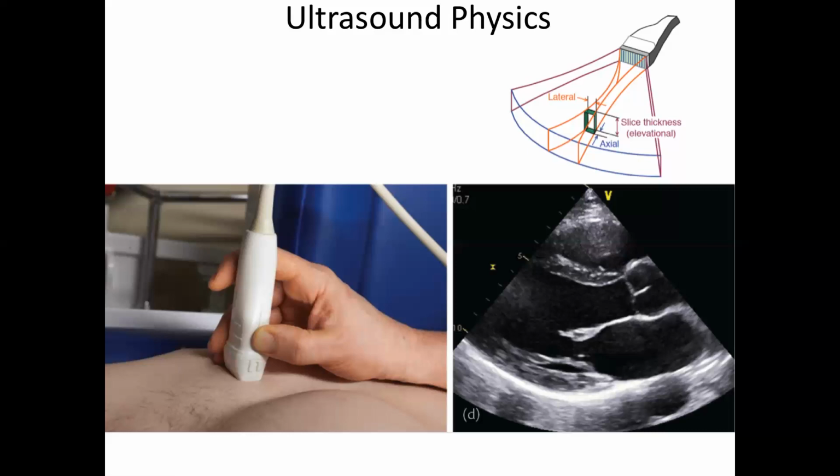Instead of just having a 1D transducer that is a certain dimension, we can break it up and make it 2D, and then phase delay some of these elements to focus it in both the lateral dimension and in the slice direction, right? So yes, there is a way to make that higher resolution.